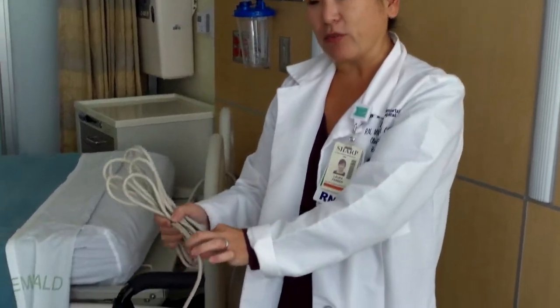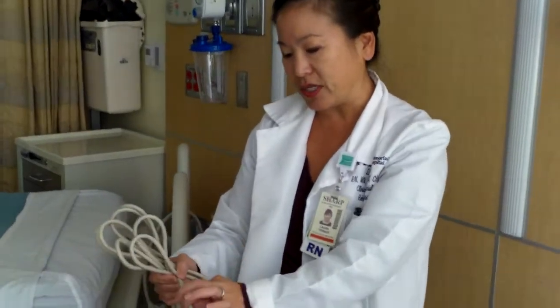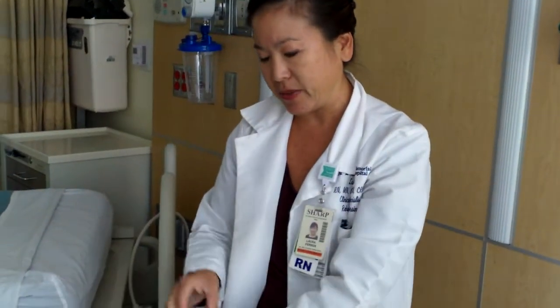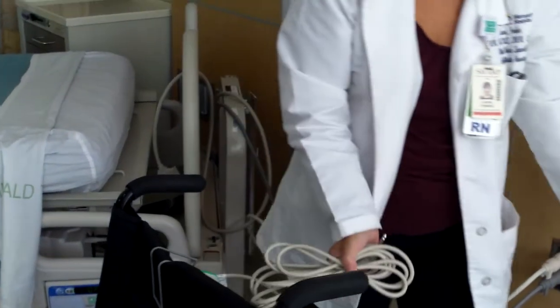So we'll be getting something like what you have on your laptop power cords, the Velcro straps, so that will be on the cable, and then we'll just tie it up and leave it here. That reminds us that when the patient comes back in, then we need to connect them back into the nurse call system.